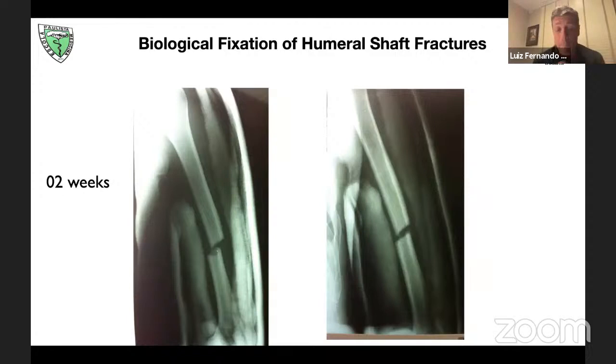I suppose many people will decide for open reduction and internal fixation because this is a single fracture. You are able to compress the fracture, using traction with a regular plate strong enough to fix this fracture. Why did you decide for an anterior bridge plate? The less invasive, the better.